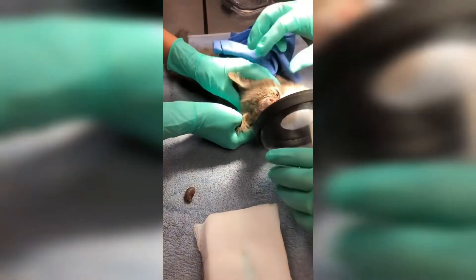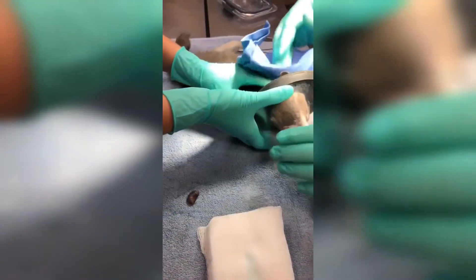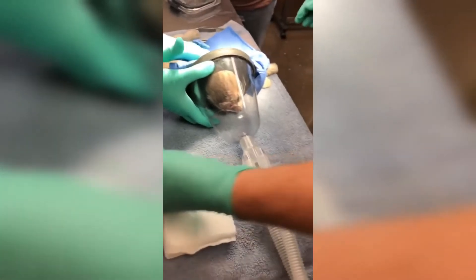Once removed, the vet then places a tube over the animal's face to make it easier for the animal to breathe and prevent it from suffocating with the leftovers.